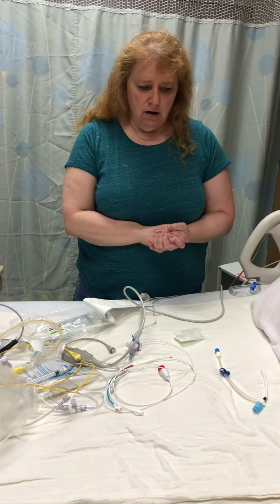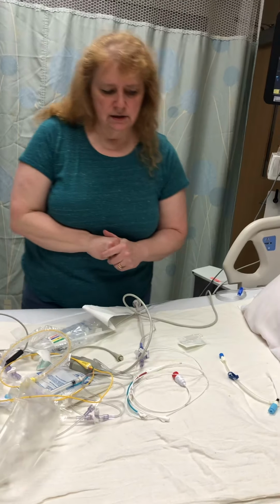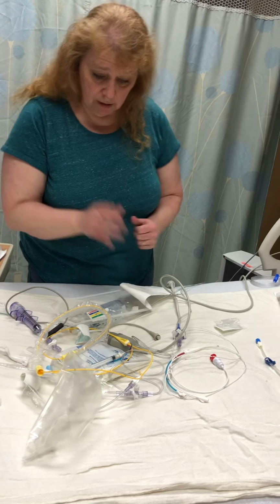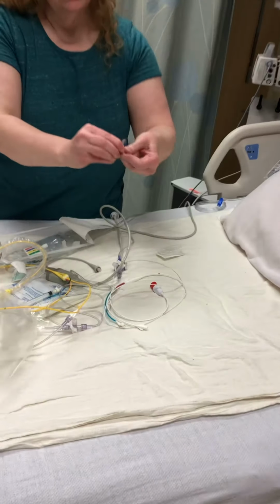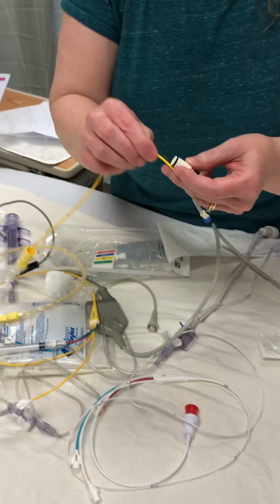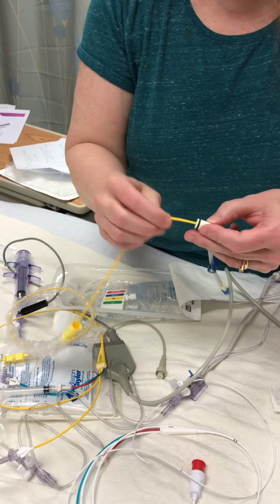So that's how you would discontinue the swan, and then just go ahead and document it like you normally would in Epic. A couple other things with the swan. You saw how there was that little notch there. I'm just going to put this back in here like this.